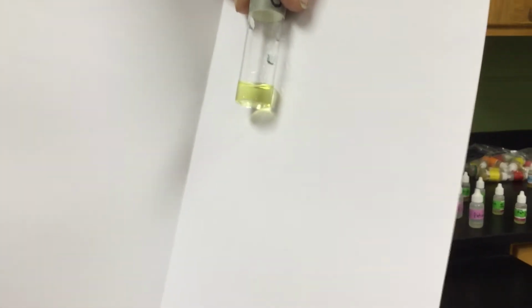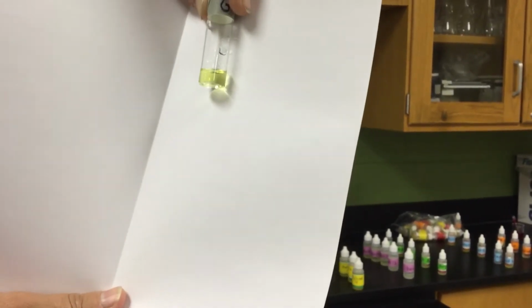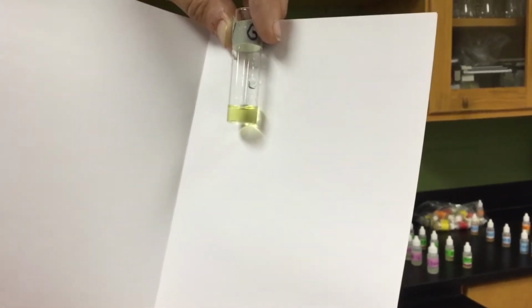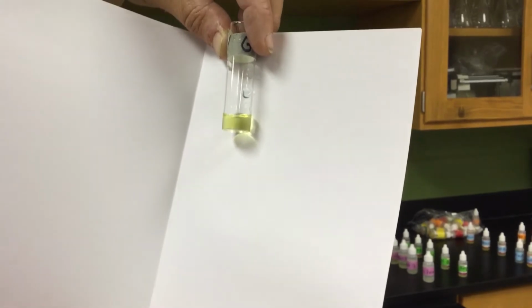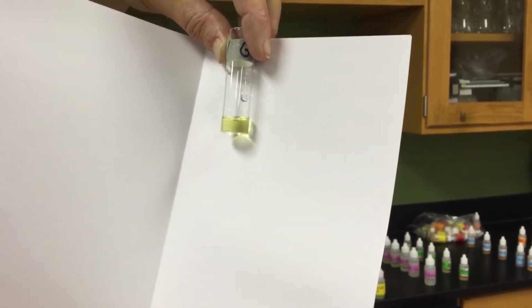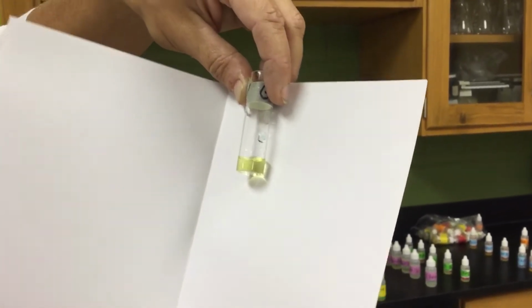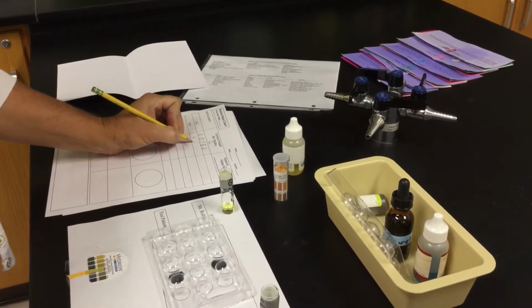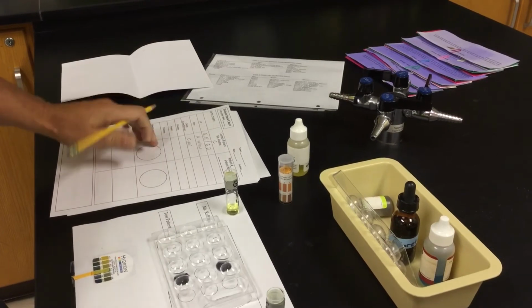The next is clarity, and I want to know the turbidity of it. What I mean by that is, is it clear? Can you see through it? And this you can actually see through. You'll see some samples maybe along the way that are actually very cloudy. And that turbidity, or the clearness that we see within there, can be caused by different things as well. And you'll see that on your data chart. So I'm going to say that it is clear, and your results here either say clear or cloudy. It doesn't really give you too much. So I'm going to say it's clear. I'm going to say my color is light yellow, and you guys are filling this right in on your Google Classroom form.